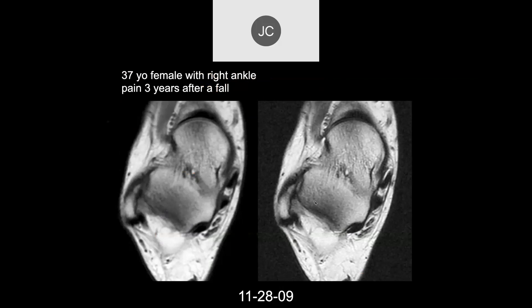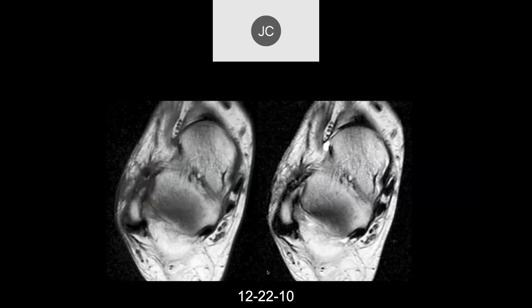Oleg, what do you think of this case? What we see is thickening of the anterior ligament with indistinctness of the margin here, and a little bit of inhomogeneous signal intensity within it. This is on 11-28-09, three years after the patient had a fall and had persistent right ankle pain. This is now on 12-22-2010.